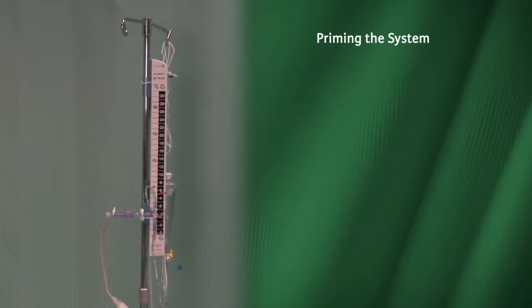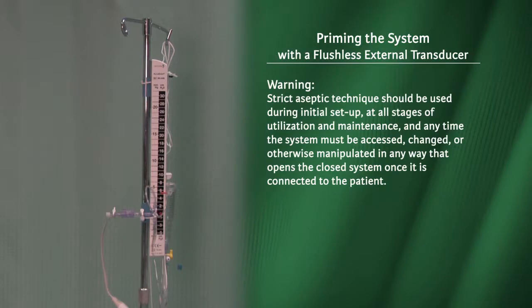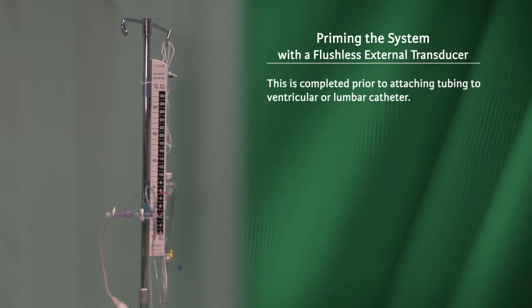Priming the system with a flushless external transducer. Strict aseptic technique should be used during initial setup, at all stages of utilization and maintenance, and at any time the system must be accessed, changed, or otherwise manipulated in any way that opens the closed system once it is connected to the patient. This is completed prior to attaching tubing to the ventricular or lumbar catheter.